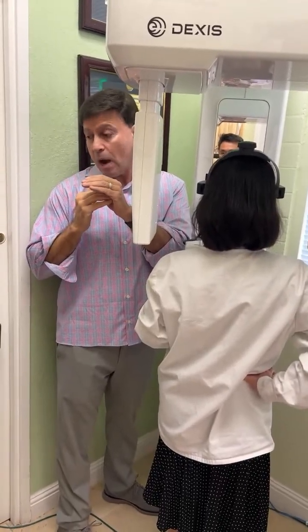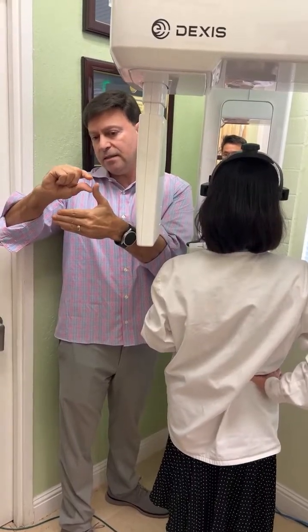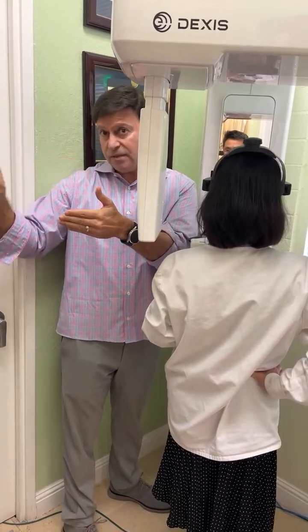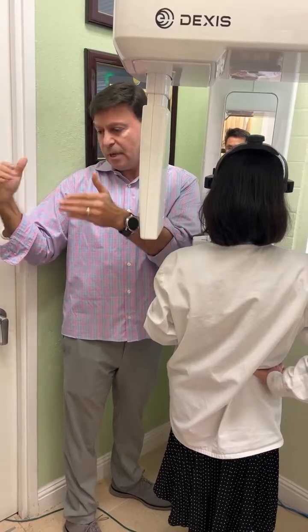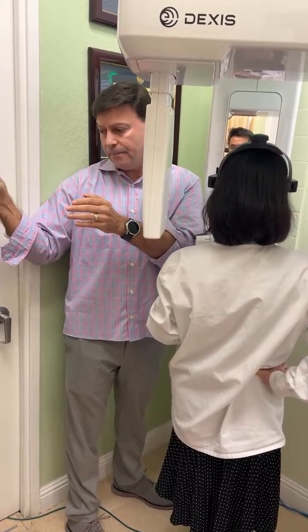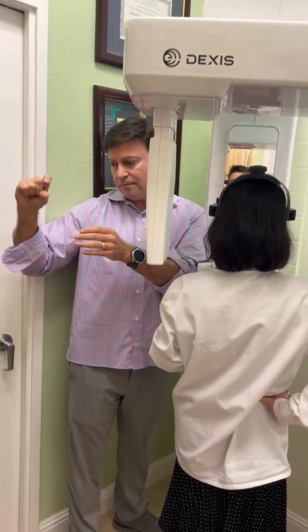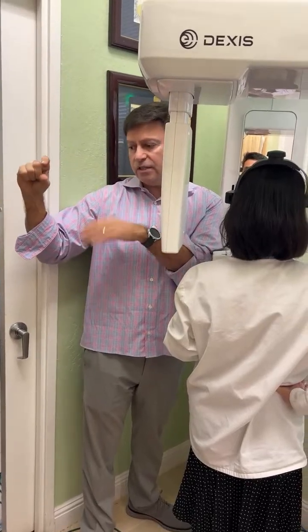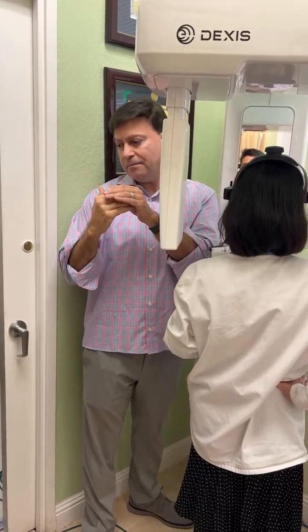And then you're going to see an air pocket across the pano. It's going to come from here, right across the maxilla, across the apexes, coming all the way around and down, and you're not going to be able to see the roots because it's all black, because it's an air pocket. By smushing the tongue up, you avoid the air pocket and you don't get that burnout area. And it'll vary in thickness depending on how much they relax their tongue. So you'll see some really thick, dark line, they really just dropped it. Or it might be just a little sliver. So they just barely dropped it.